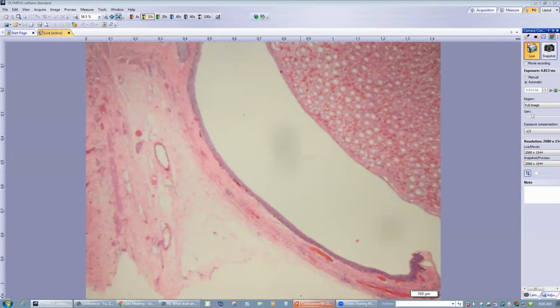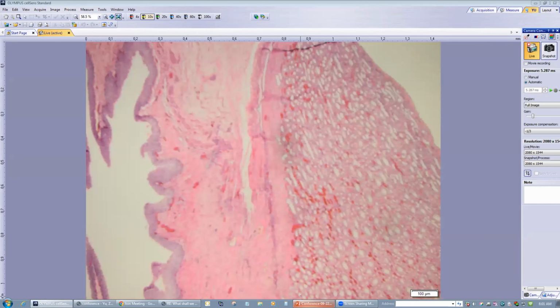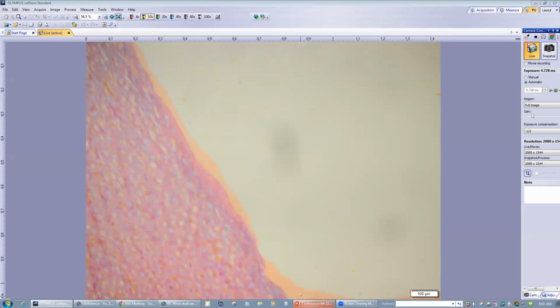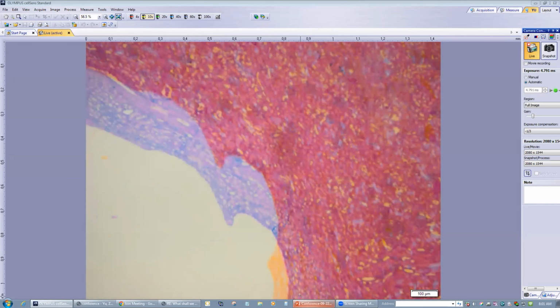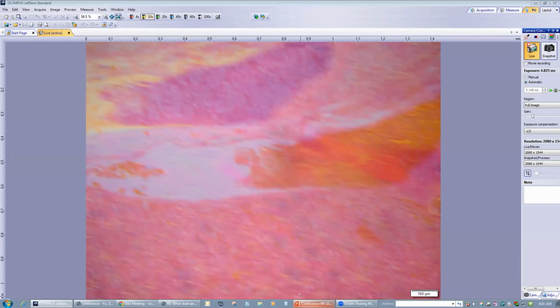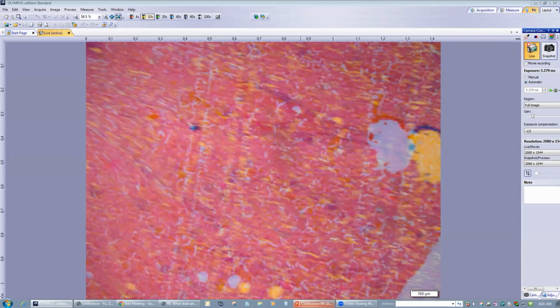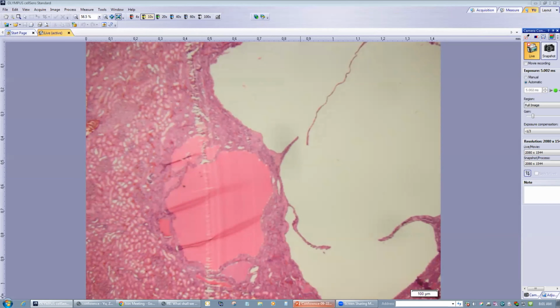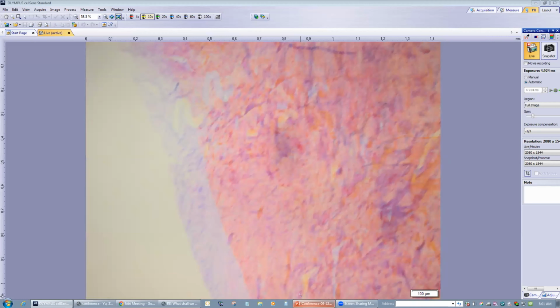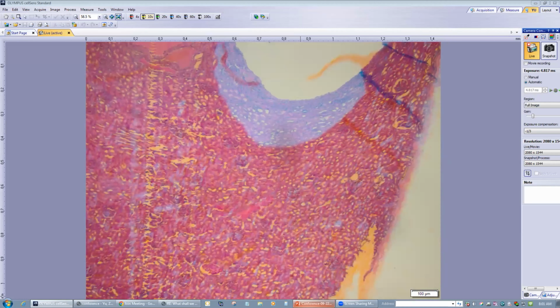That's the kidney, and that's one cyst. Those kinds of small cysts, they followed for a while. Now they have grown into a mass. Those kinds of cysts are bilateral and slowly growing. There are a number of cysts and tumors in this slide.